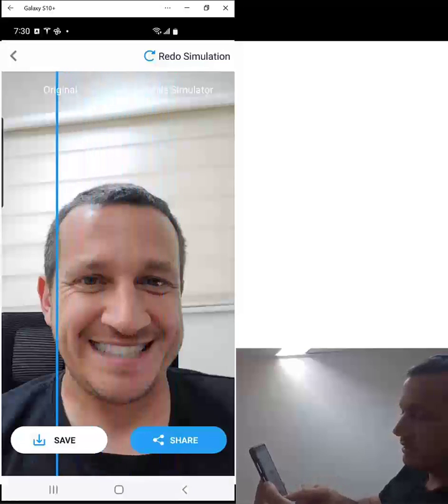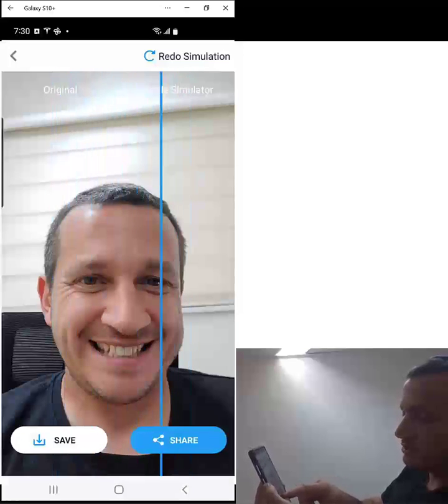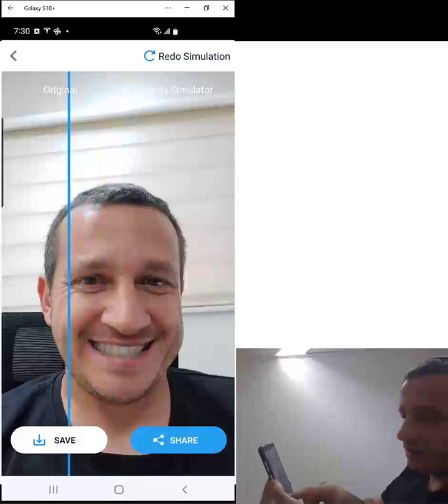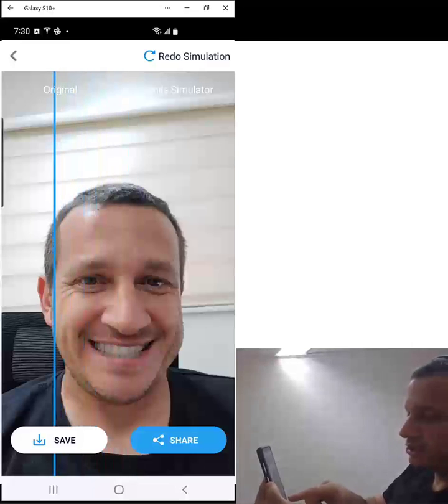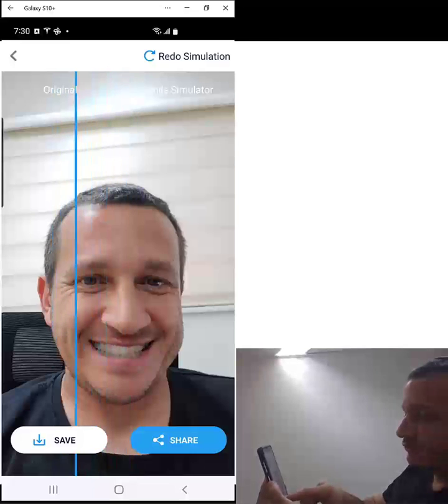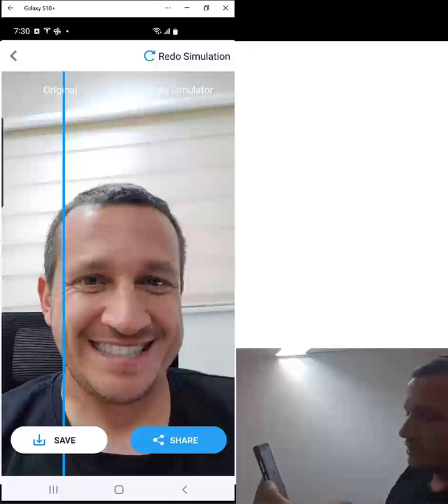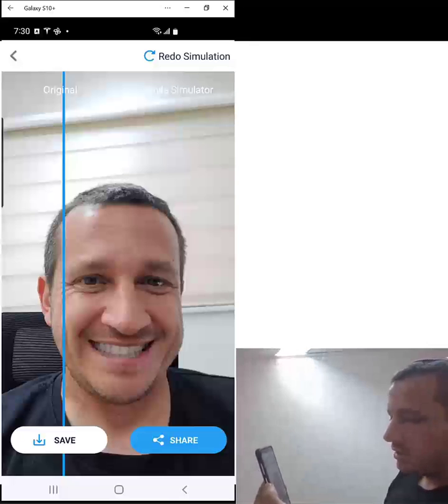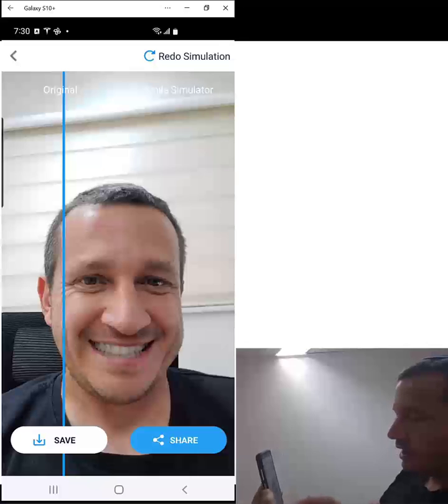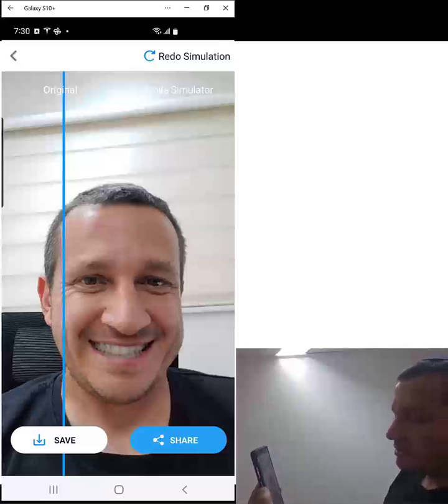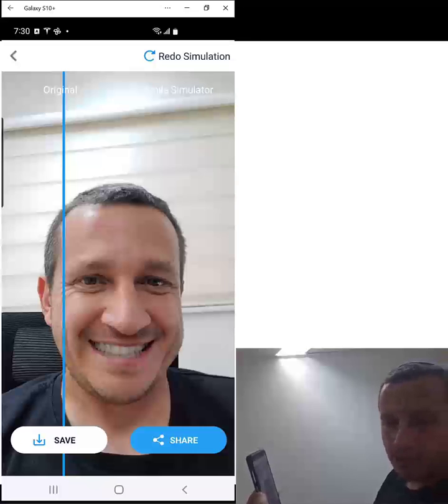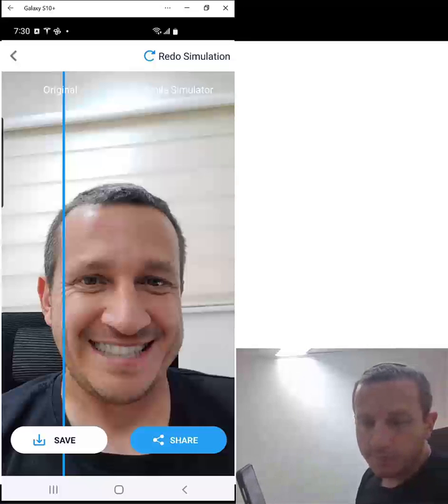Sliding to the right shows the original, and sliding to the left shows the simulation. You also have options to save or to share. If you click save, it will download the photo with the simulation to your media gallery. If you click share, it will open up options to share the photo via your messaging apps and your social media apps.